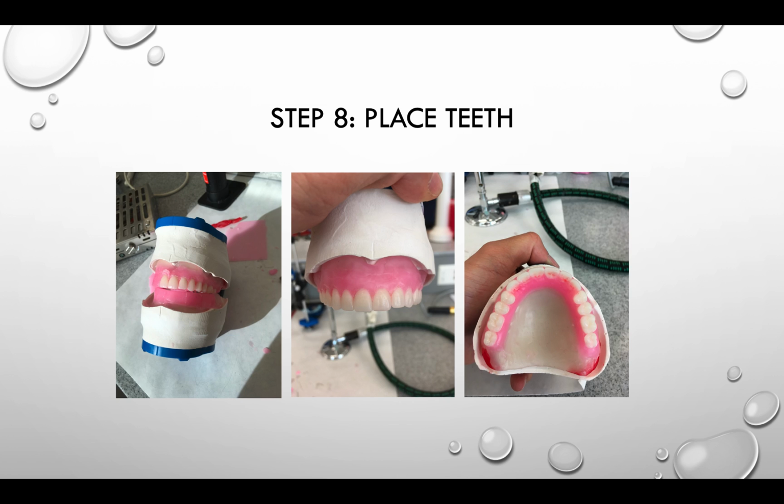It is important to get the midline just right, or else the dentures will look pretty bad and you will have to redo the entire process. This step really gave me an appreciation for the lab techs. I thought my teeth looked pretty good until I saw the wax try-ins downstairs when Dr. Durham was trying them in on the patient and realized mine looked bad. I'm glad I'll never have to do this step in the future, or else my patients probably would never come back to me.